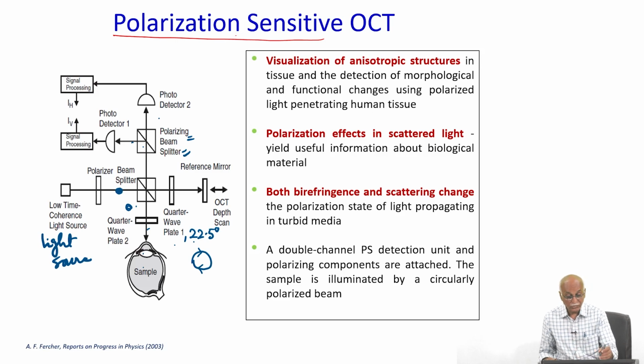Basically, it is used to visualize anisotropic structures, and to get information related to tissue and biological material characteristics in terms of their properties.